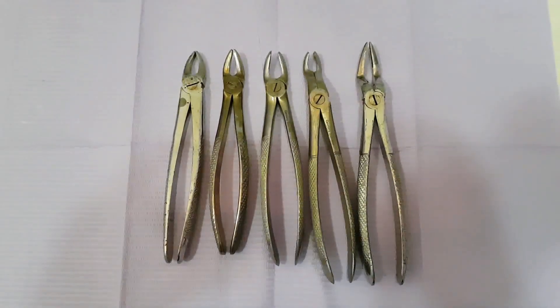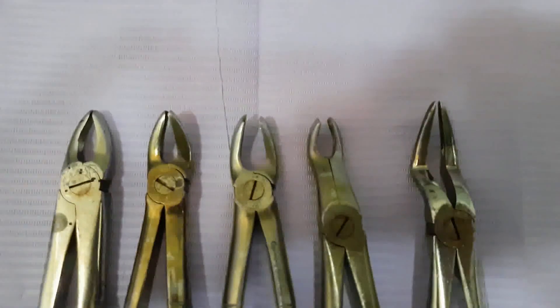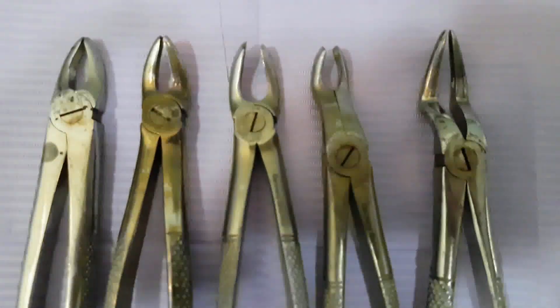Hello everyone. In this video I want to show you all the forceps that are used for tooth extraction in the upper jaw. Here you can have a close look at them.